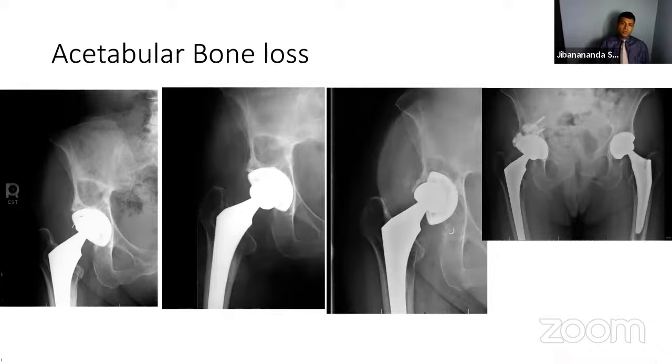So if you want to accept this, then I would probably recommend bone grafting from a window supralaterally, or whichever way you can access that acetabular area. The other option is to revise it and fill it up with augments. I put 2 augments here. There are 2 dome augments essentially filling the cavity. This is about 2 years post-op.